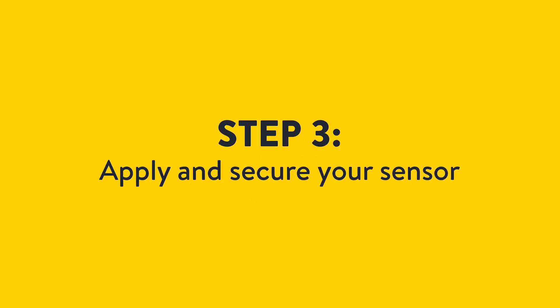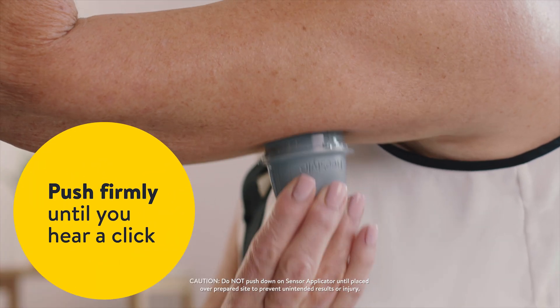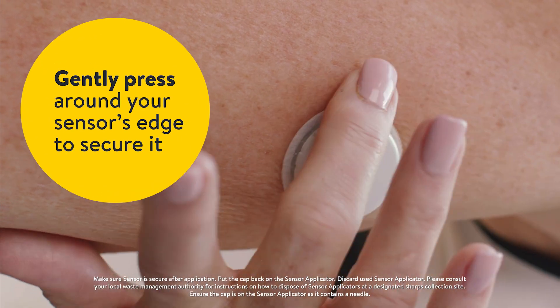Now you will apply and secure your sensor. Place the applicator over the prepared site. Push firmly until you hear a click. Gently press around your sensor's edge to secure it.